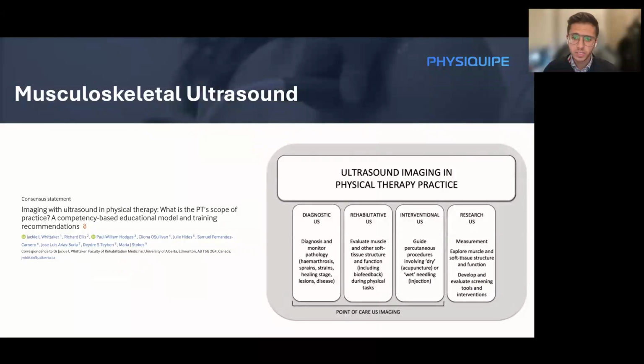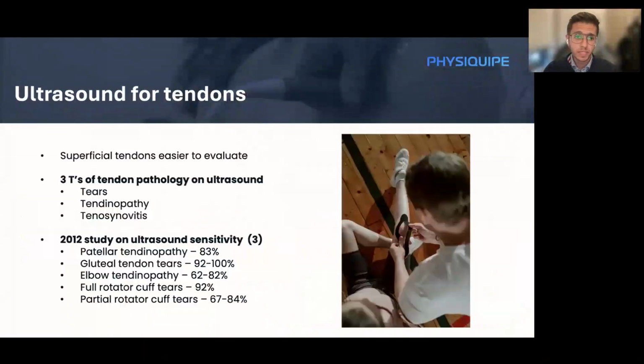So we've already talked about the diagnostic side and the rehabilitative side, but of course, there's a whole side of interventional ultrasound and research ultrasound. So we know that studies in sports medicine have historically relied on patient-reported outcome measures. Obviously, in the S&C world, we do have more objective measures, but in SEM, ultrasound really is becoming a fantastic tool to look at more objective markers, particularly with the more controversial interventional treatments that are coming out into the market. And actually, if you can show with ultrasound that you're making good tissue recovery, then that can sometimes add to your clinical practice and evidence base.